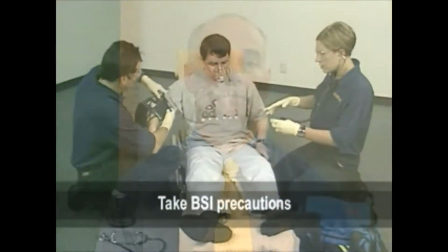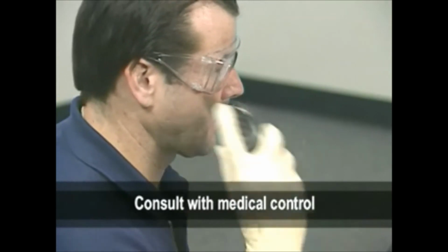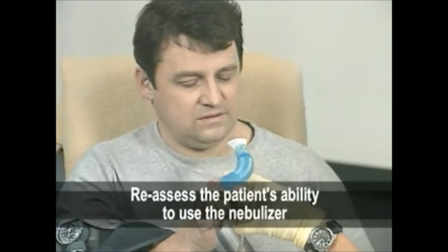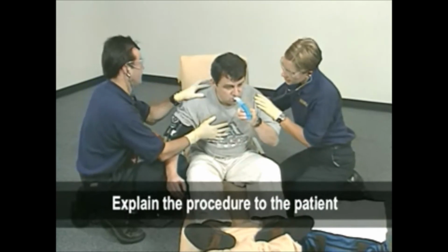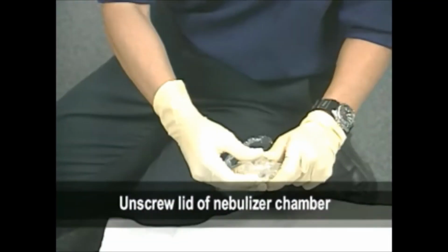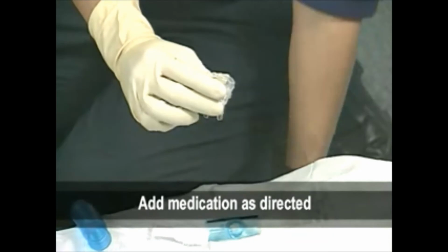Let's take a closer look at the steps involved. Take BSI precautions. Consult with medical control or follow local policies and procedures. Reassess the patient's ability to use the nebulizer. Explain the procedure to the patient. Reconfirm the 5 rights of drug administration. Unscrew lid of nebulizer chamber. Add medication as directed.